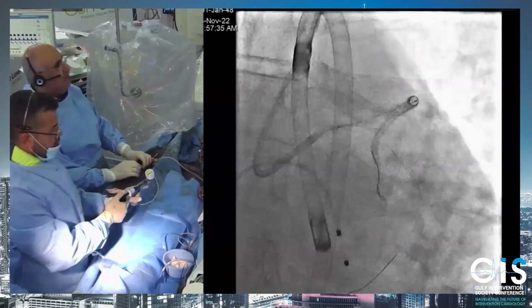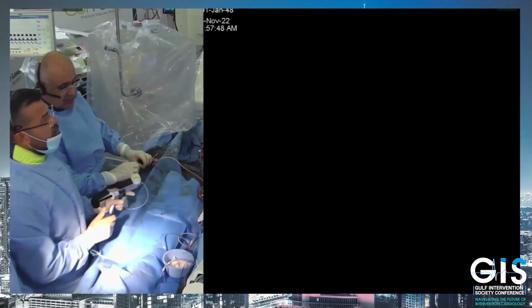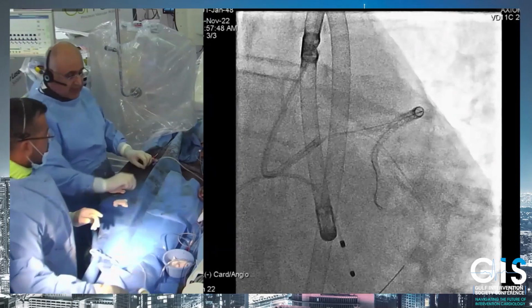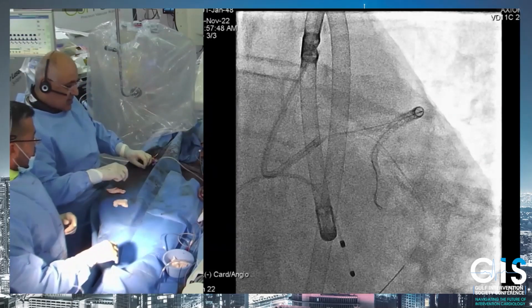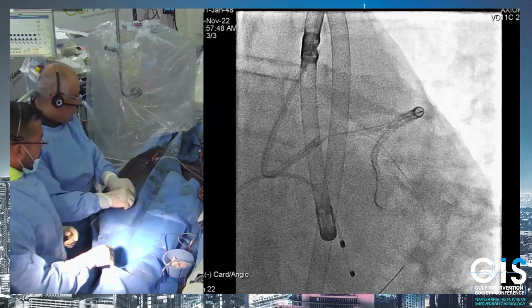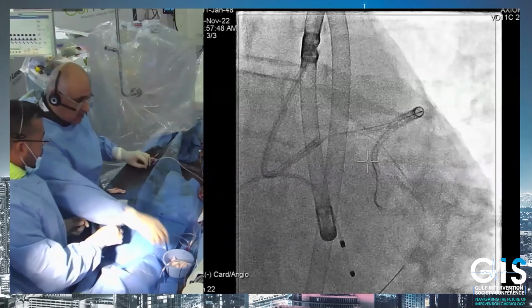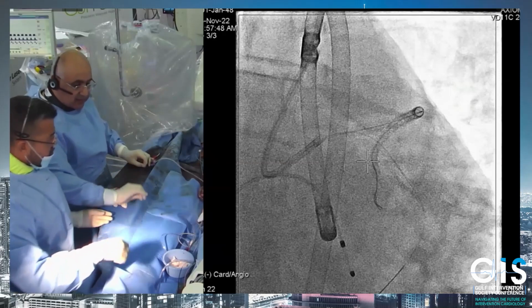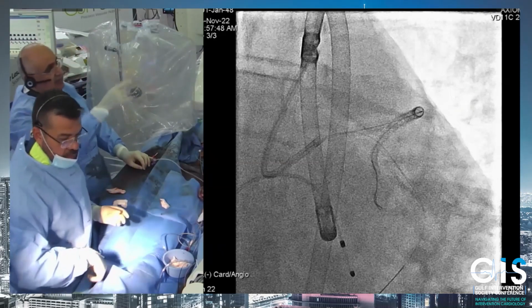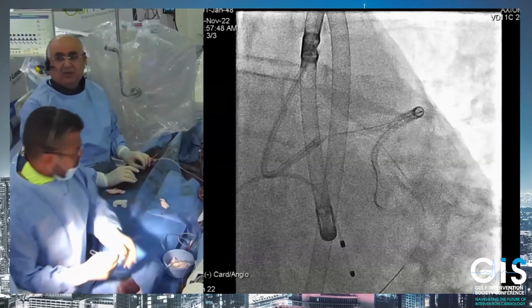Again, please. Though we believe IVUS will have a role in left main, we know that, but to quantify this calcium and use the calcium MLD max scoring system with the Ultreon would be really interesting to see, and to put a strategy of stent and length of the stent and all that kind of morphology understanding. This all will affect our decision at the end. We don't forget that there is another lesion proximal to the old stent in the mid segment of the LAD. So that's what I'm doing now. We'll take an image, I hope.